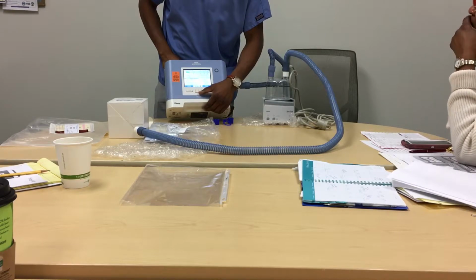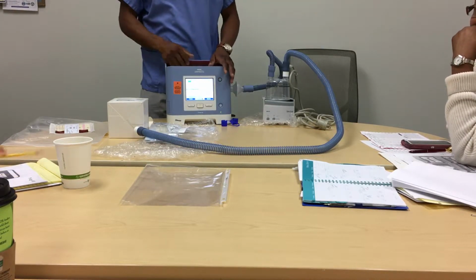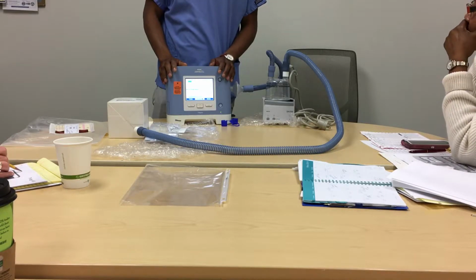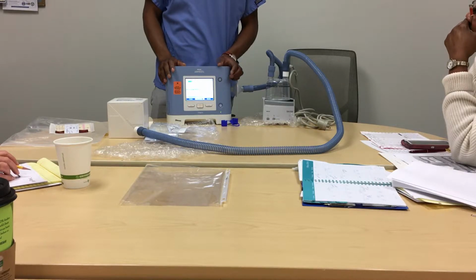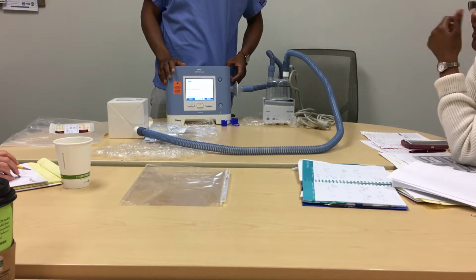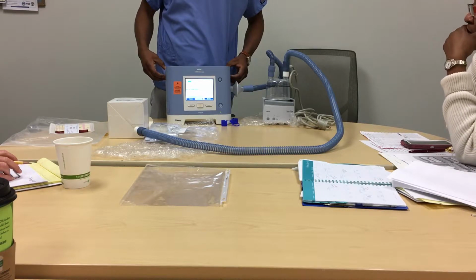I have a question. When you're talking about the pressures, your max pressure is 25, if I remember correctly? Correct. So if I have a max EPAP of 10, and I have a max pressure support of 20, is that going to exceed the 25? It will not let you get as high as 20. Right, so it is additive. Correct.